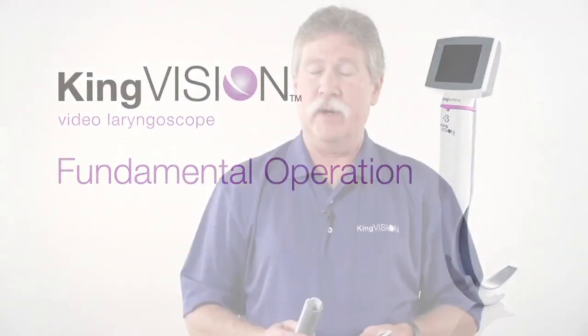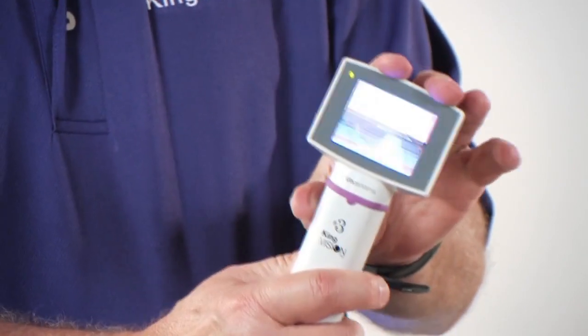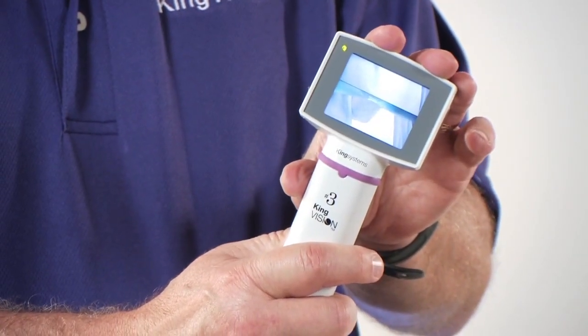In talking about the fundamental operation of the King Vision Video Laryngoscope, it's important to remember that because the imaging sensor is in the blade, you will not get an image on the display unless the two are connected before you power up. If you power up without the blade, you're not going to get an image. If you then attach the blade after the fact, you'll get a split image. To correct that, just power off and back on again.